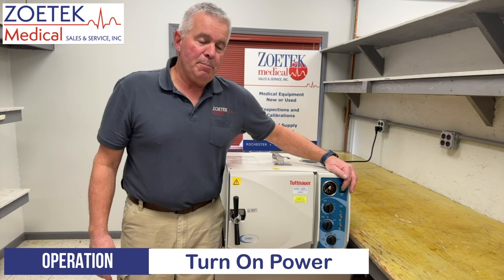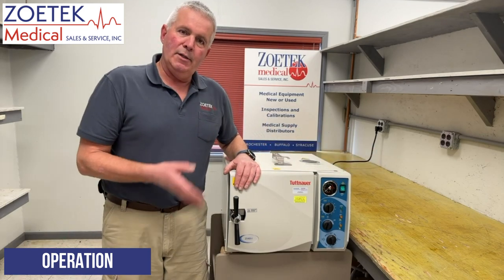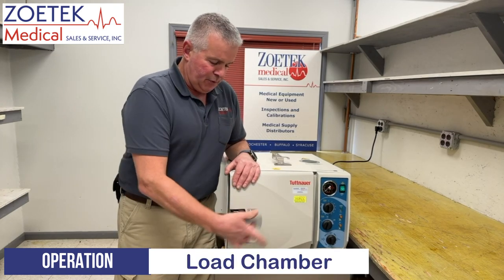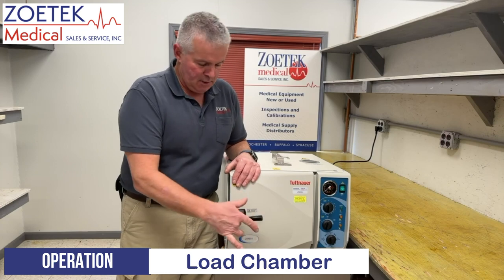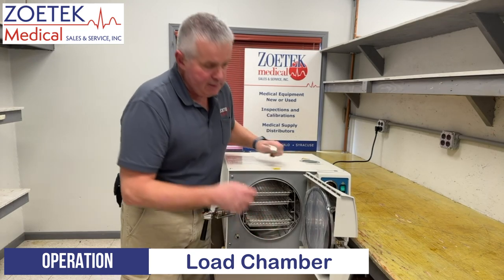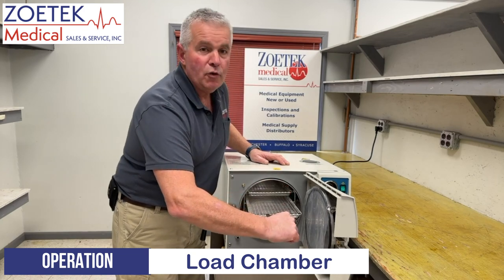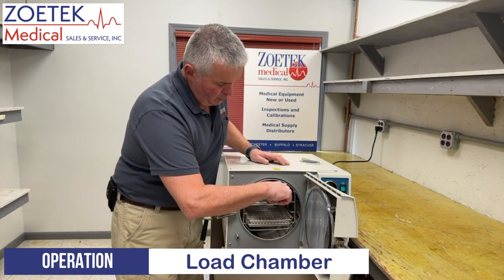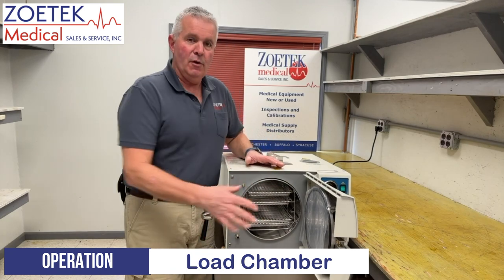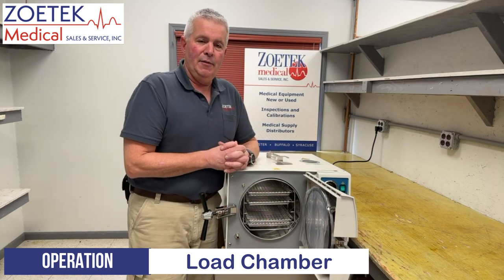First we're going to turn our power on, and then we would want to load our chamber with whatever it is we want to sterilize. We unscrew this handle, rotate it to the side, and our door will open. Inside you'll see our trays. New ones come with a little tray holder that allows you to remove trays when they're hot. If you don't have this, you could use an oven mitt — just be aware that those trays tend to be very warm. At that point you would put whatever you want to sterilize onto the tray.